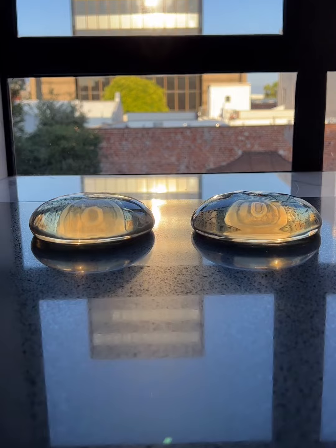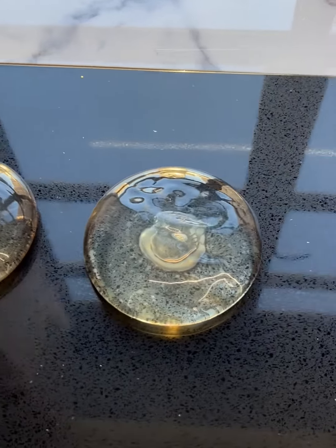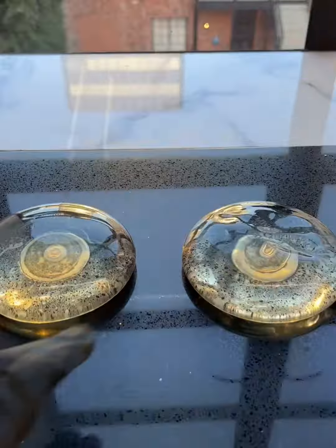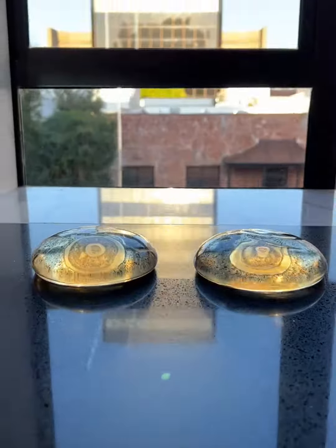Next, let's talk about fill and cohesivity. The more full and cohesive, like the silicone implant on the left, the more firmness and upper pole cleavage in the result. There is also less chance of rippling seen through the skin, although the chance of this is low with silicone implants in general.